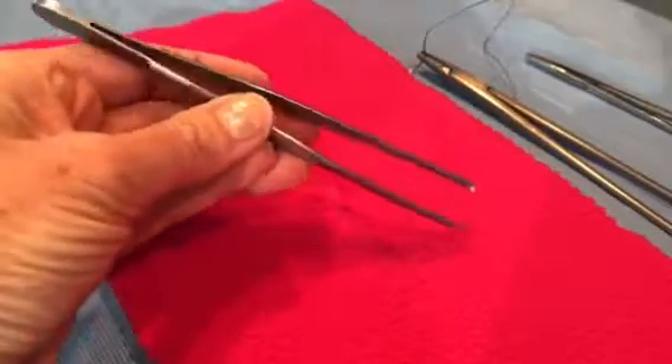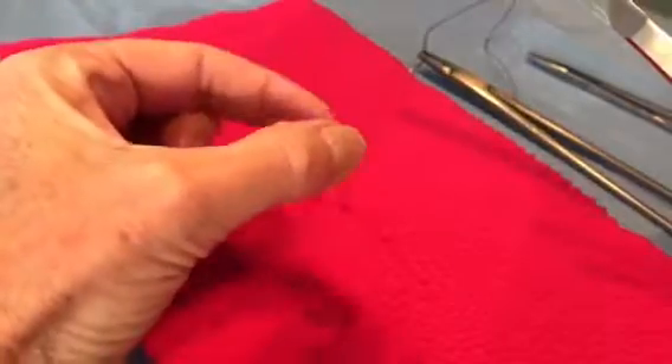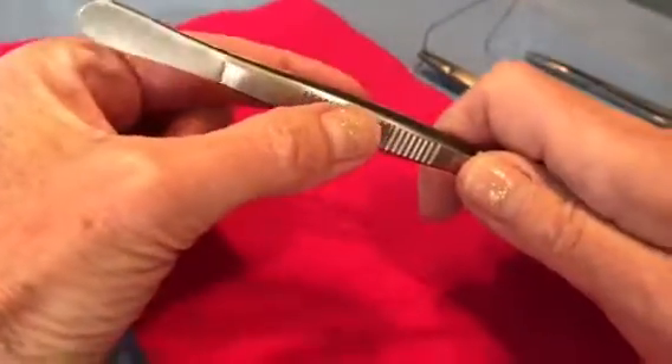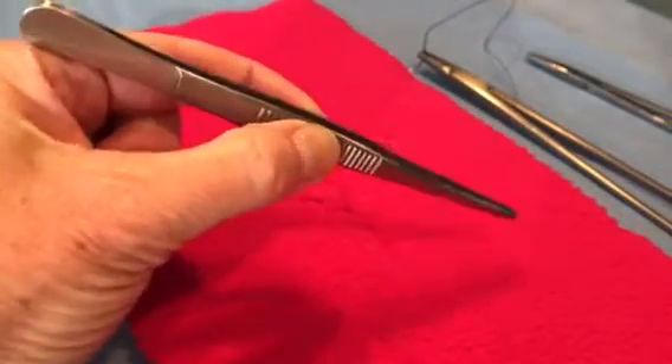When holding tissue forceps, you're going to hold them as an extension of your pincer grip. So if you practice this little motion, and then just simply slip the tissue forceps in there and practice. It'll take time to get used to it.